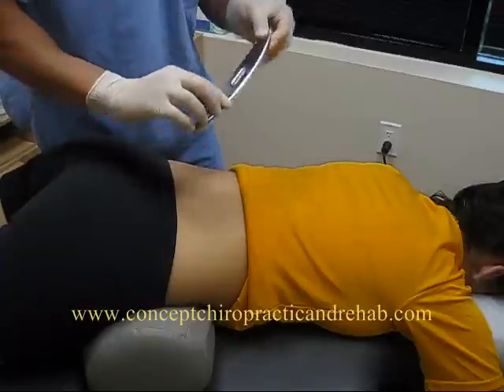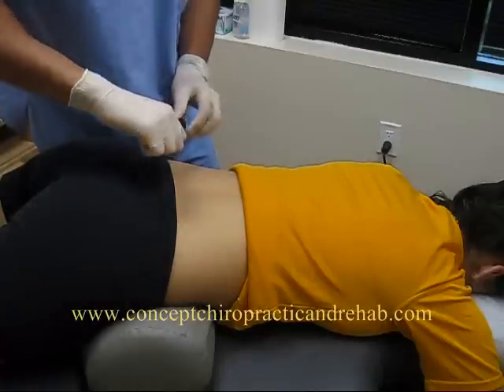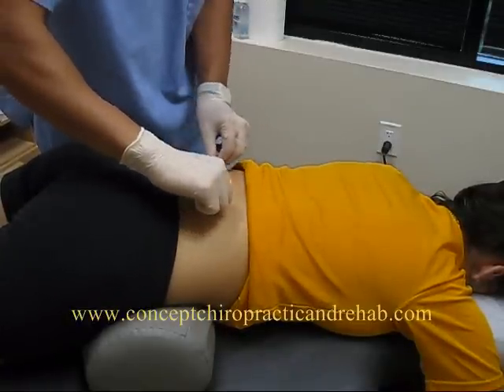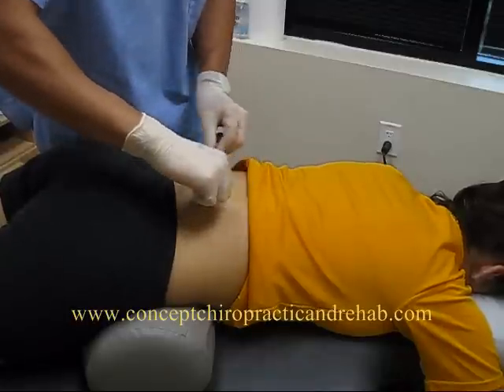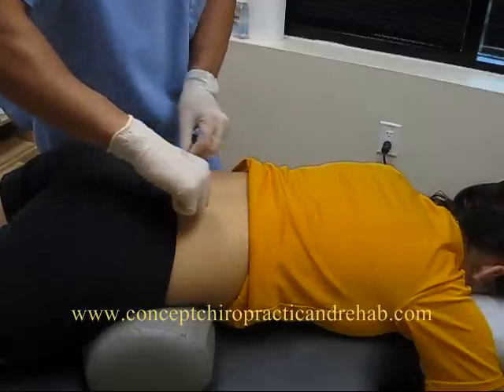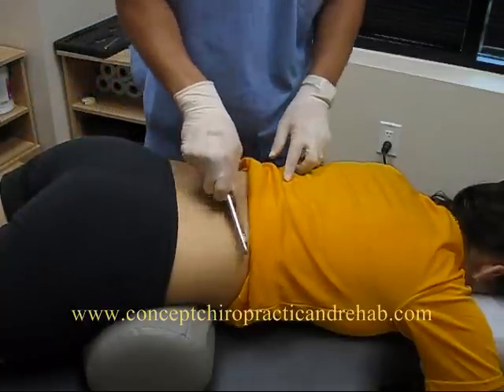So basically, this is the Graston technique tool that I use for several different joints in the body, but we're going to use this tool today on my patient here. So in this fashion towards the head, I would go very deep, depending on the case and depending on the chronicity of each condition, and work the muscle like you see right here. And really, we would do each side depending on the case. But in this case, this patient is dealing with low back pain on either side.